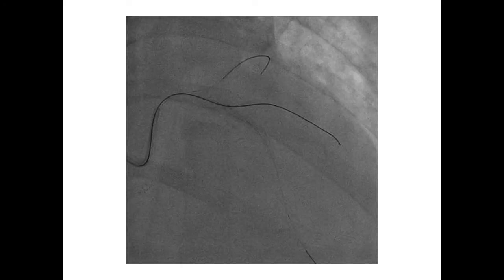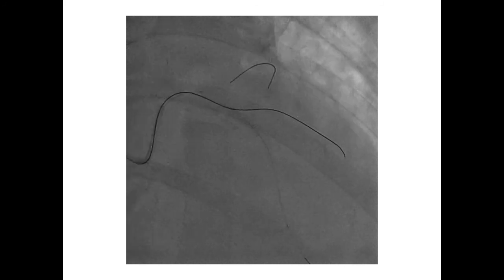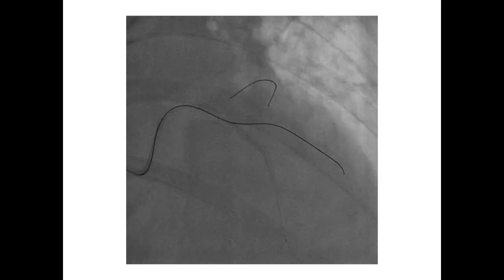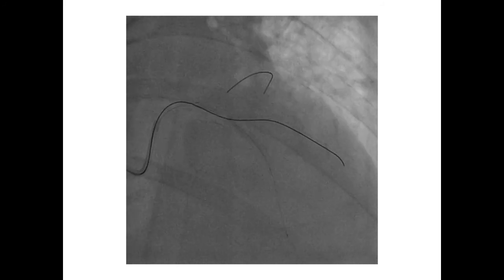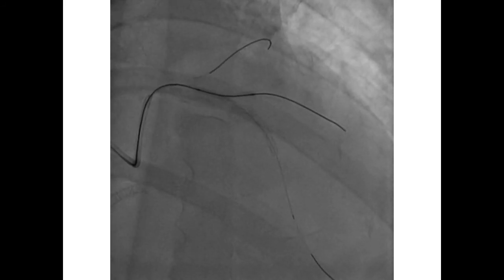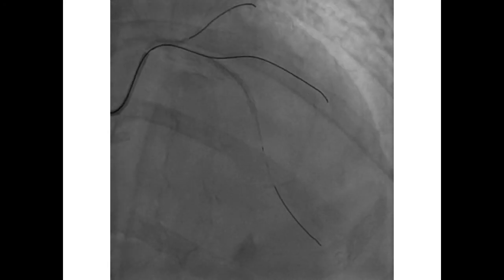So we brought here the NC Nano Hydro 0.85, and as I told you, you can barely see it with a radio-opaque shadow, especially when the wire you're using is a radio-opaque wire like the Fielder XT. But the NC Nano was able to cross into this calcified diagonal through the stents, and it was able to give us a channel. After we used this channel, we were able to deliver bigger balloons, and once we did that and we re-established flow in the diagonal branch, the patient was revived and her blood pressure started to build.